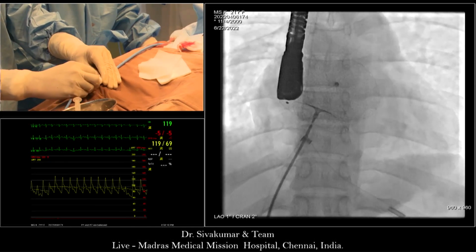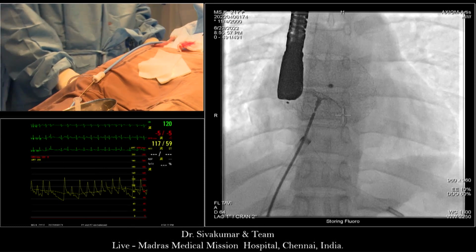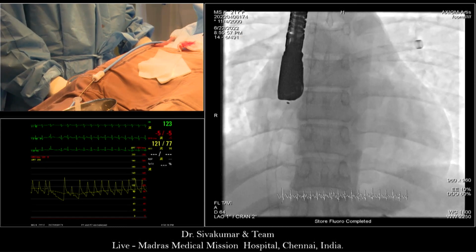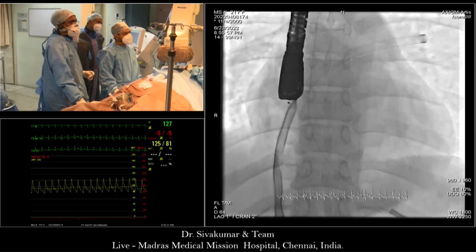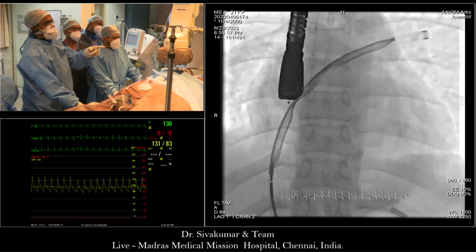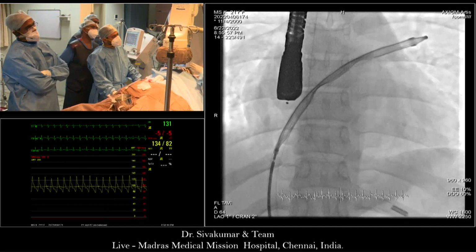So Srinath's question about this. Fluoroscopy and show it. Okay, Siva, again recheck the positions. I missed the deployment in there. I'm showing you now, Iqbal. Wonderful. I'm sure it looks beautiful. Let's have a look.